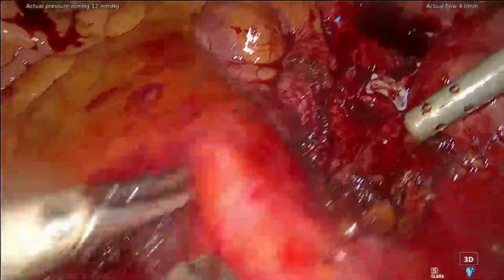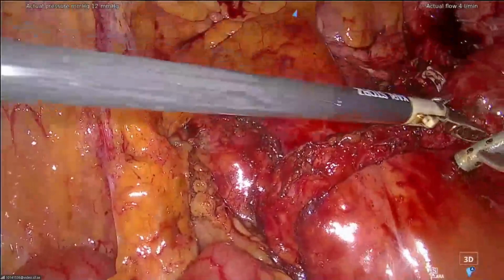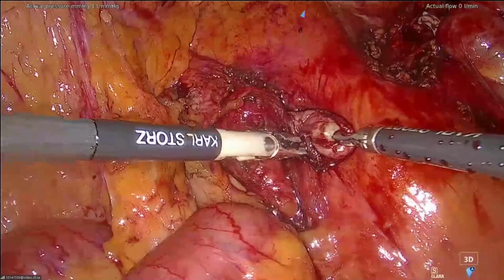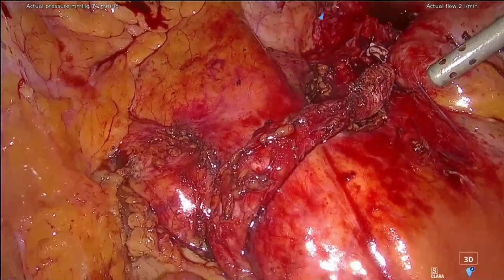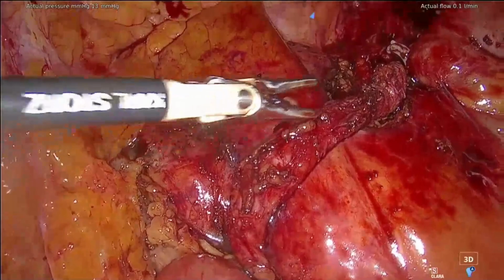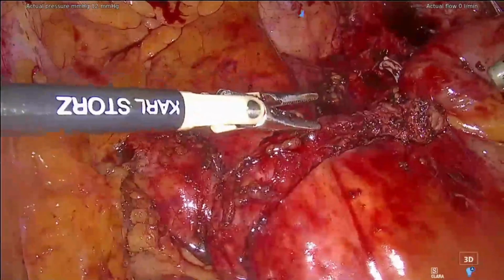Camera back. Okay. Yeah. Does someone have access to the nephrostomy? It can be very interesting to inject, because one of the questions, of course, is to be sure that we have removed all the stenosis. But I think that the stenosis was really at the anastomosis. And of course, if I have fibrosis, I also have to consider the place to cut. Because if it's blocked up to here, I can start to consider cutting the ureter from here to somewhere there, and I have to sacrifice the distal part. But I think that when I see that, probably I will cut at this level, as I believe.